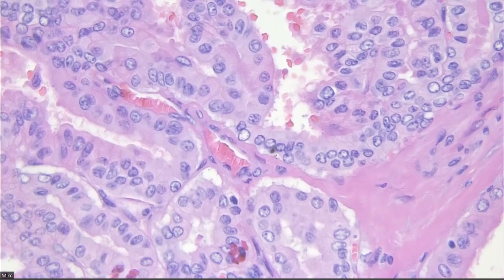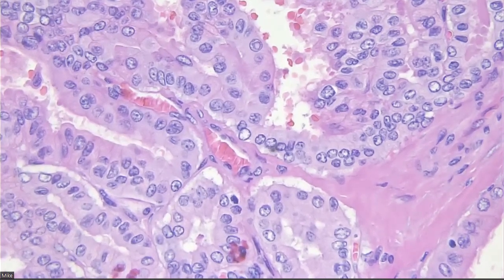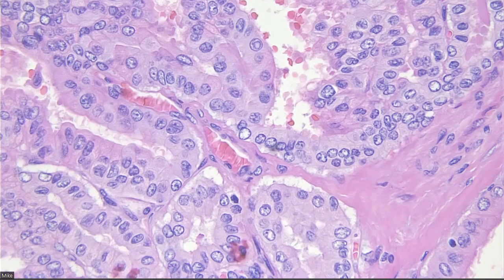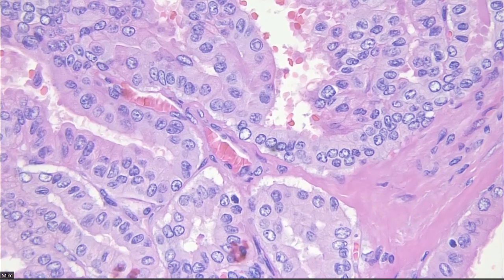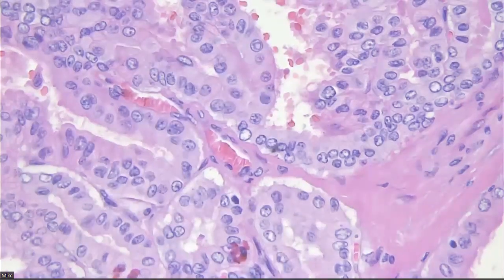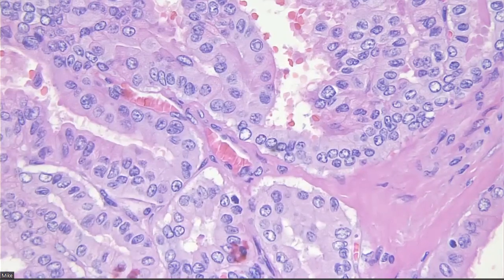Non-invasive follicular thyroid neoplasm with papillary-like nuclear features, which basically means a circumscribed thing like this, made up of mostly follicles like this, with nuclei that start to worry you for papillary carcinoma like this, right? By definition, those cannot be invasive, those cannot have BRAF-V600E, those cannot have any good, well-developed areas of branching papillae like this do. Although, you know, we can argue about what papillae truly are, right? And lastly, in my opinion, shouldn't really have true good intranuclear cytoplasmic pseudo-inclusions.